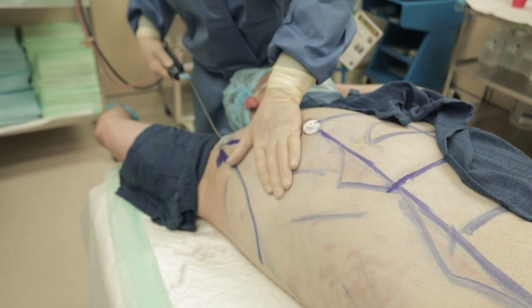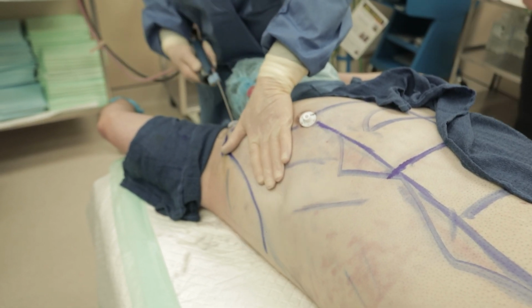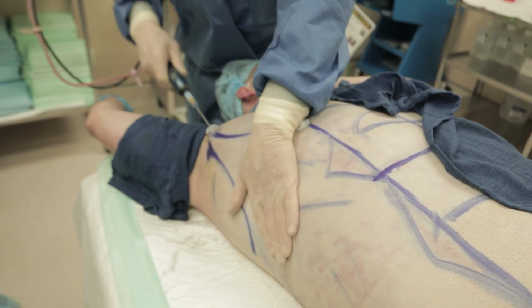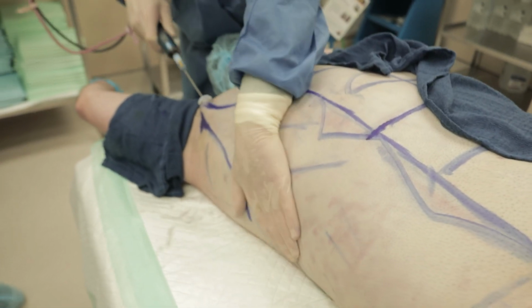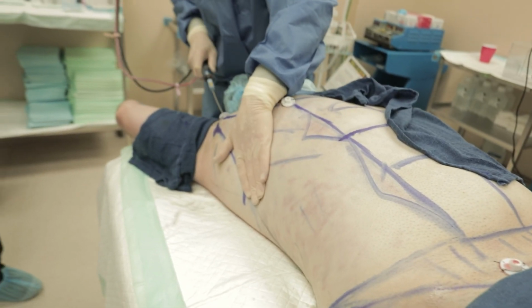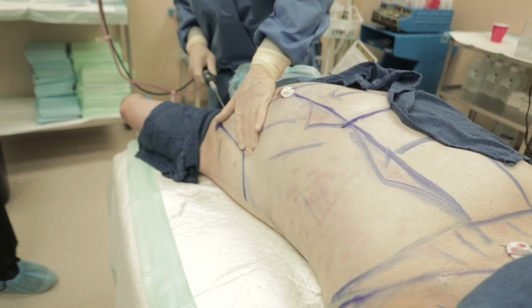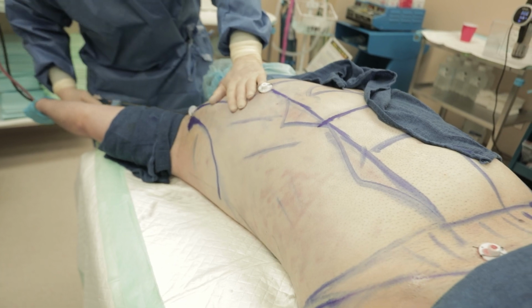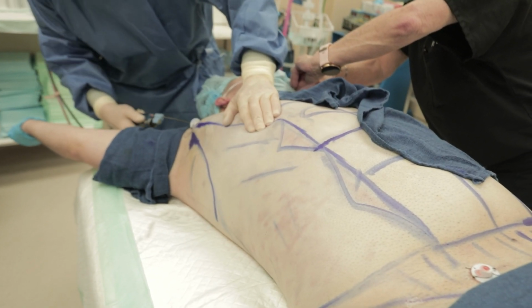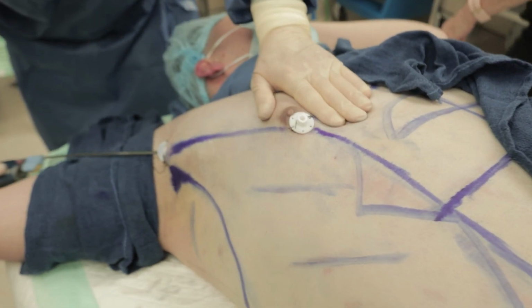To consider what gynecomastia is, with me it's either gland removal or liposuction and gland removal. And gland removal is really for the younger people, 14, 15, or 21, in great shape, but most of the people need a little lipo and everything. So what I'm doing now is just spending time in this negative space here, getting underneath this gland.